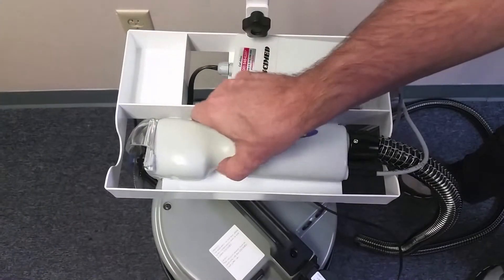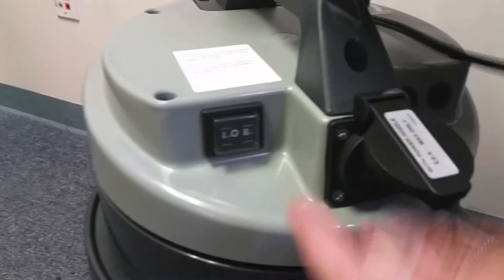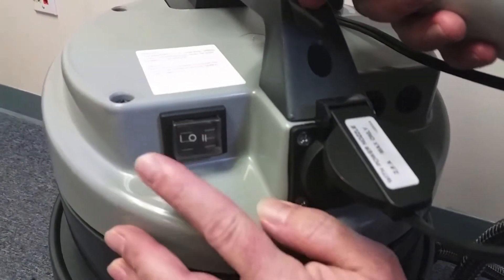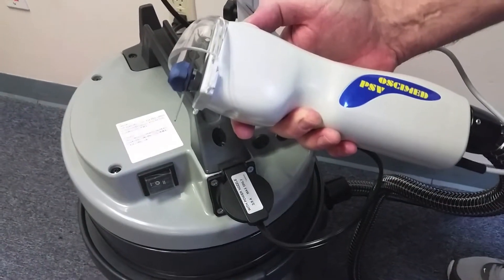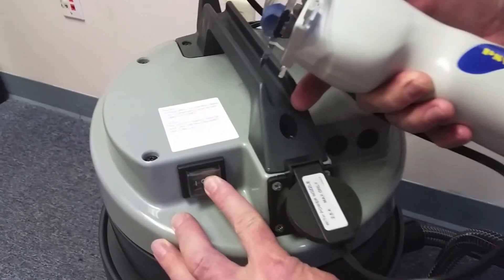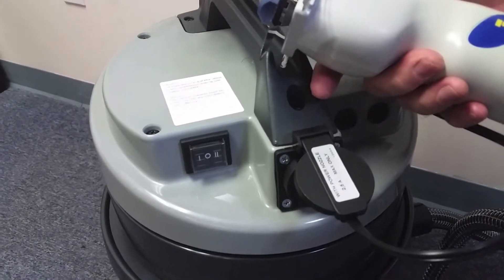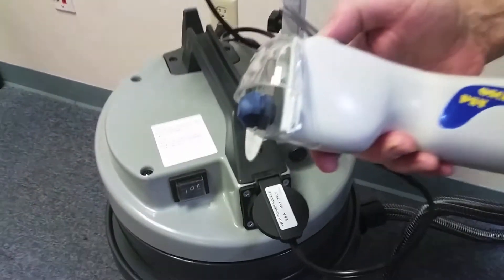The Osymed PSV vacuum cart has two modes of operation. In vacuum mode one, the vacuum will operate independently of the handset. In vacuum mode two, the vacuum will activate and deactivate using the handset's power button.